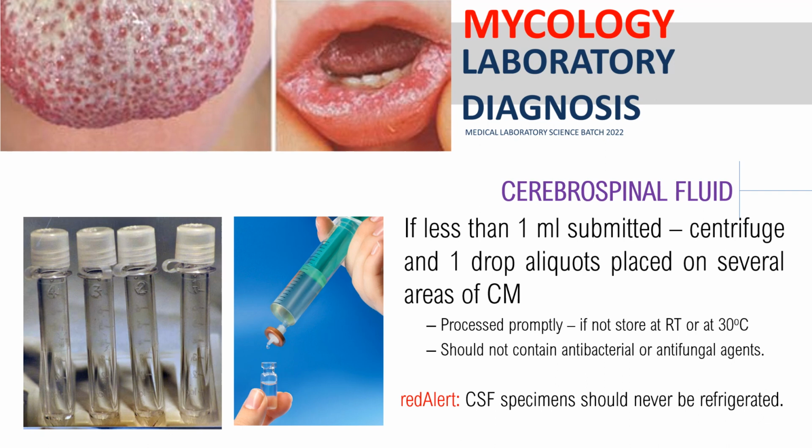Kasi sa CSF class, CSF is considered sterile. So, if sa culture media tutubo yung bacteria, it means that other than fungal infection, possible that the meningitis is caused by your bacteria. Kaya dapat i-consider din natin na other than fungal, merong bacteria.